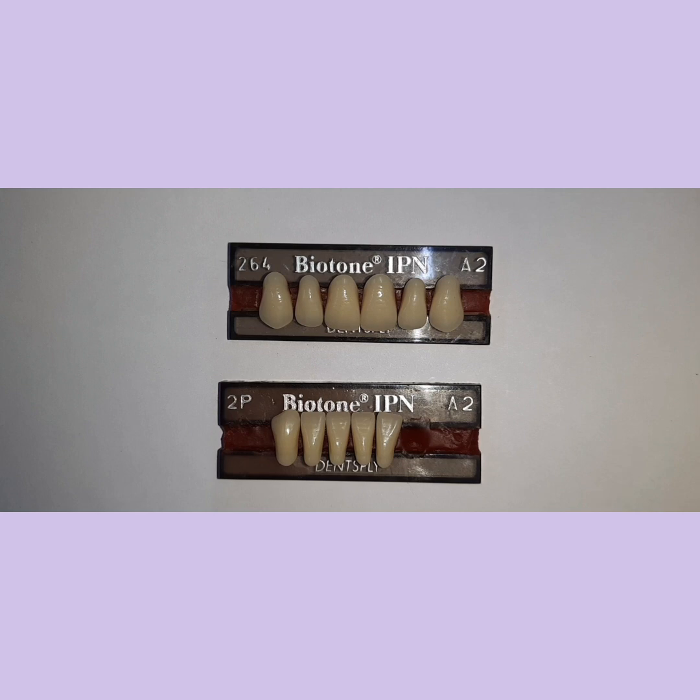You should visualize from a distance of 6 to 8 feet, and teeth should always be visualized from different angles, so that any kind of shadows or different light falling on the teeth does not interfere with or influence the shade. And there should be a harmony between the color of the teeth and the color of the skin, the surrounding tissues, and the color of eyes and hair.